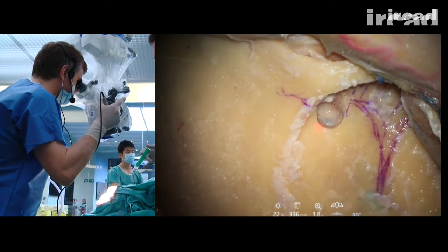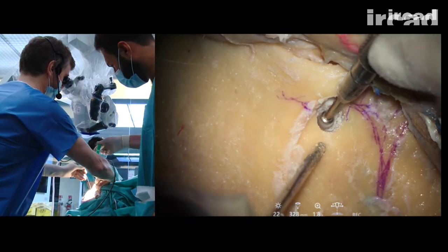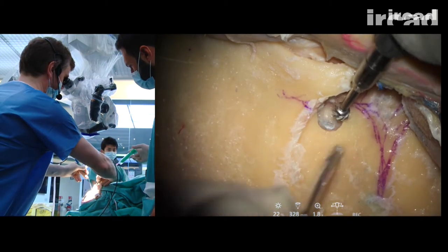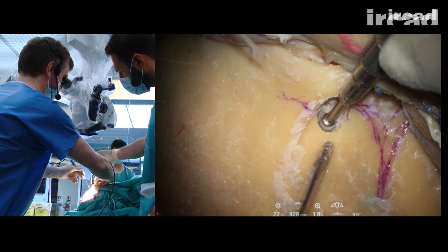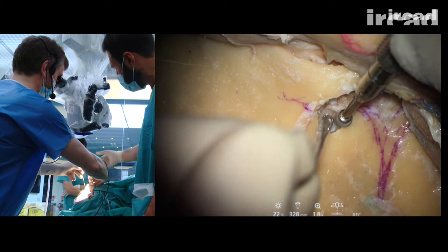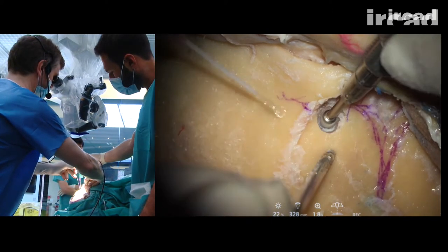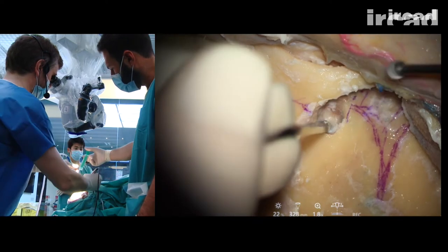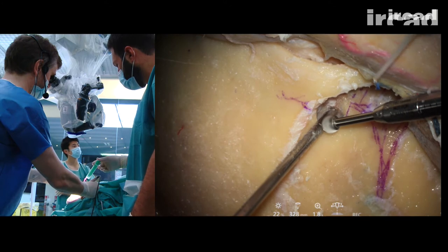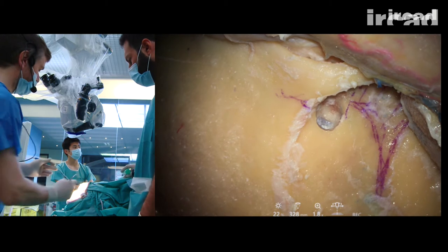So your drill should be perpendicular to the dura, especially if you use a cutting burr, because this is the safest part. The safest part of the drill is the tip of the drill. The lateral aspect of the drill is extremely aggressive, but if you drill like this, it's okay. It's less aggressive. Still dangerous, but less aggressive.